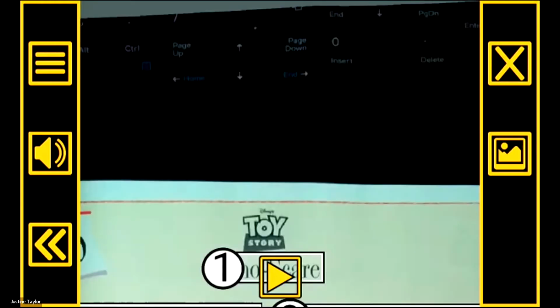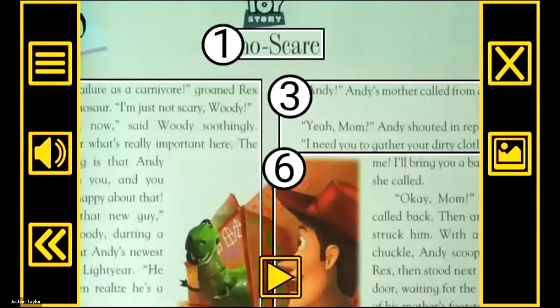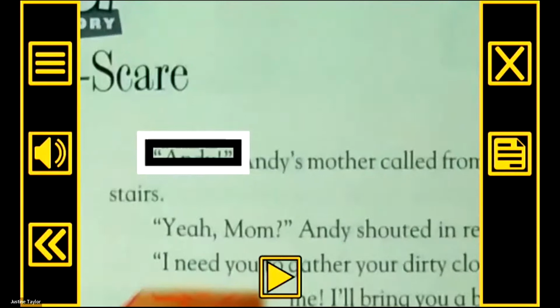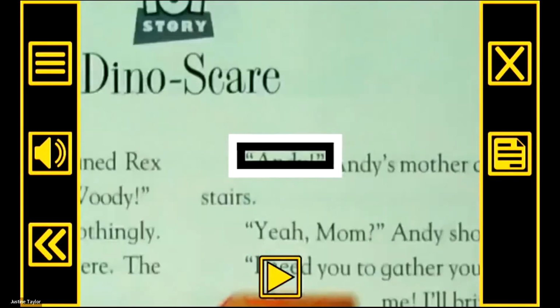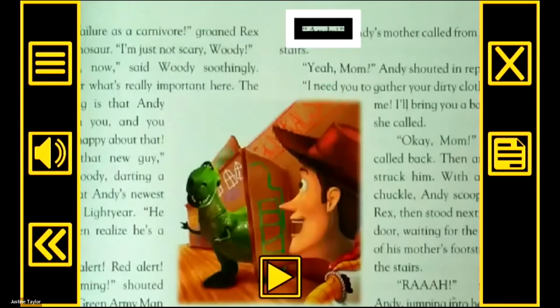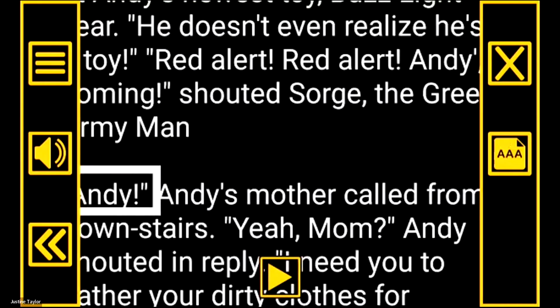Change to zone, and then you're back to your zones. Change to image mode. And like Mike was saying, his is in the live image mode, so you can select how it will read. Change to teleprompter. So I'm wondering, Nancy and Dorinda, did that fix what you were running into?